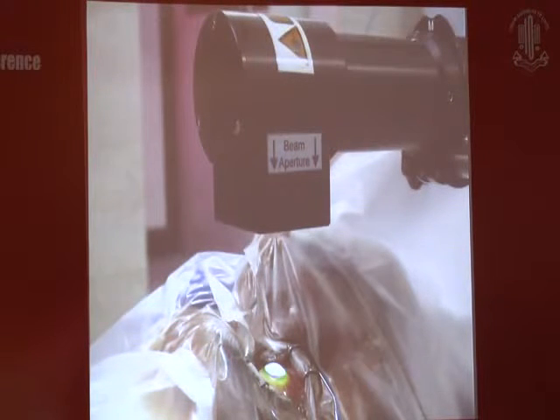In a variation of this procedure, some surgeons prefer to leave the epithelium on and do not try and remove it before applying it. And if you're doing this, you need a special riboflavin which has some epitheliotoxins in it, which allow it to penetrate through the intact epithelium. Obviously, the reason for performing the epi-on procedure is to try and reduce the risk of infection and to increase patient comfort in the post-operative period. Whether this works as well as the standard procedure, we'll see in subsequent slides.